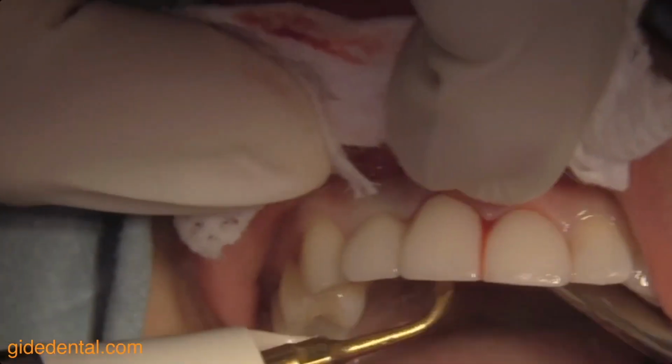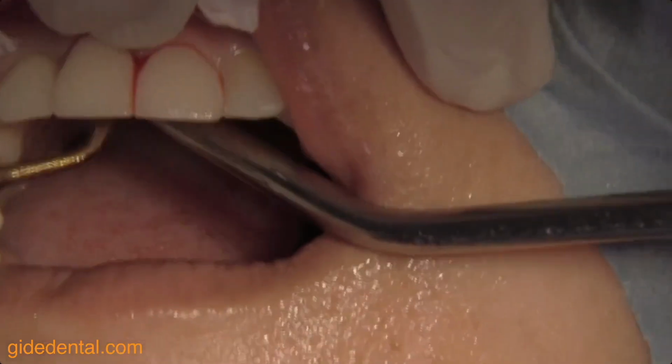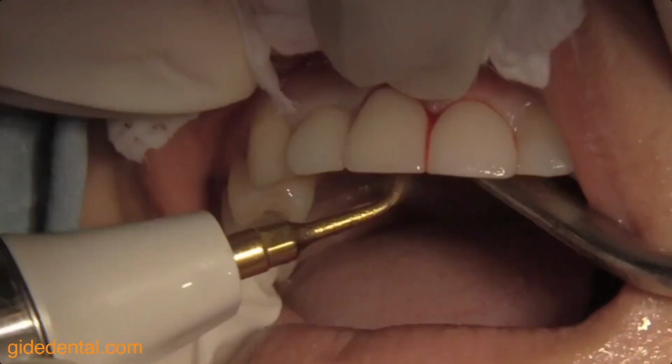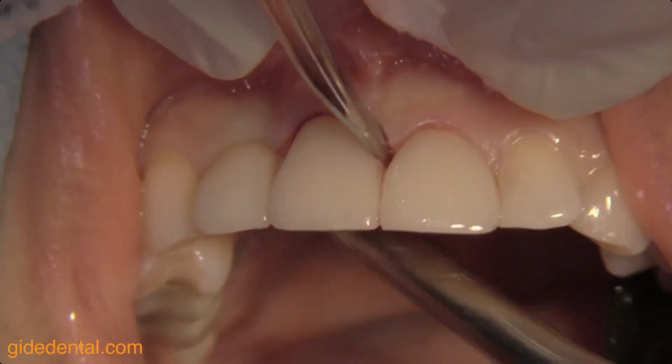Usually the bone is thicker on the palate, so here we can be a little bit more generous in the overall positioning of the piezosurgery unit. Here you can see that. A lot of copious irrigation.